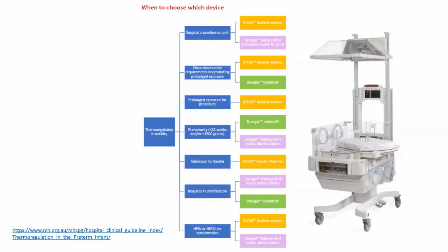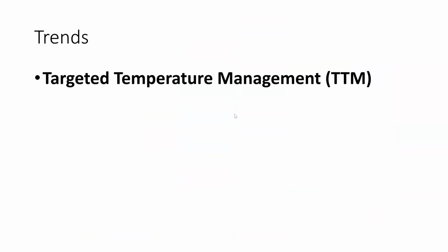And really, for most of us, these beds that convert were a game changer, where we could get access when we needed it. But then we could close the baby up and do as much as possible inside the incubator for as long as possible. So now we want to talk about targeted temperature management.